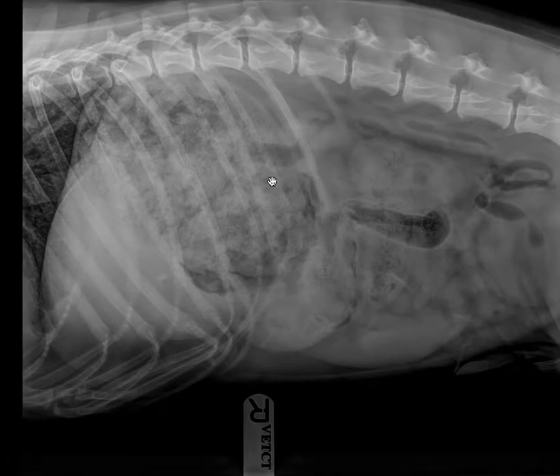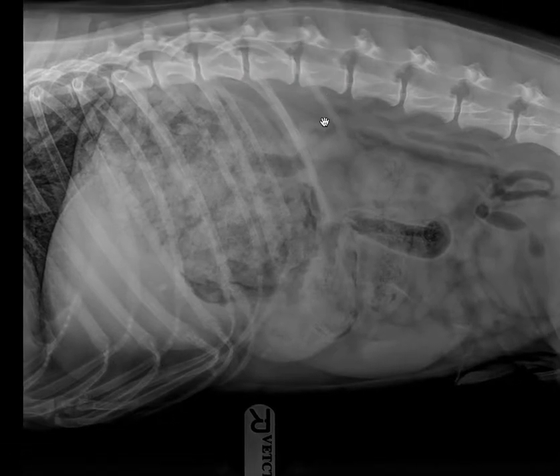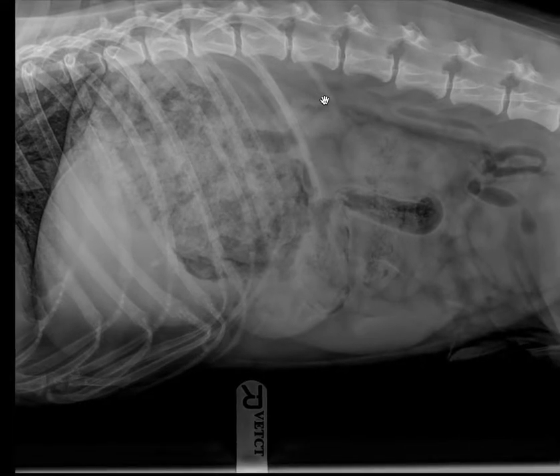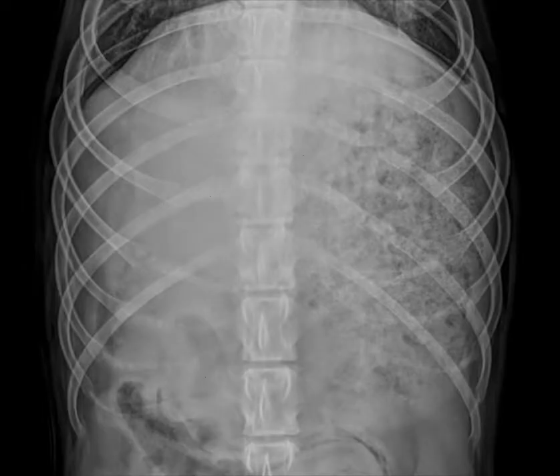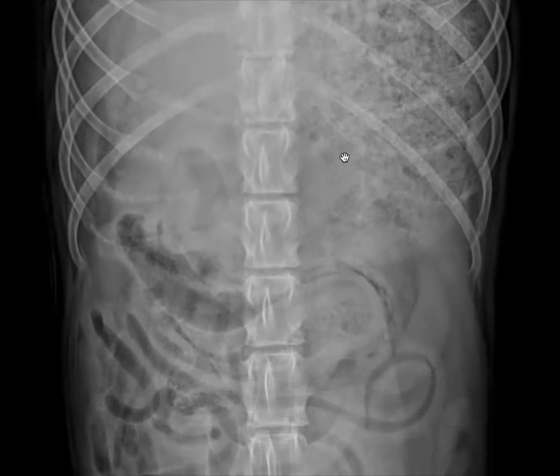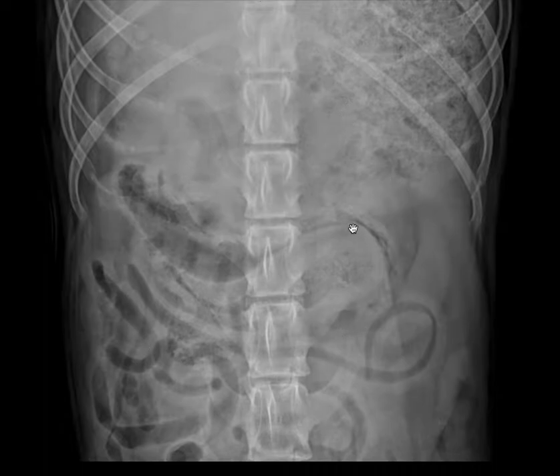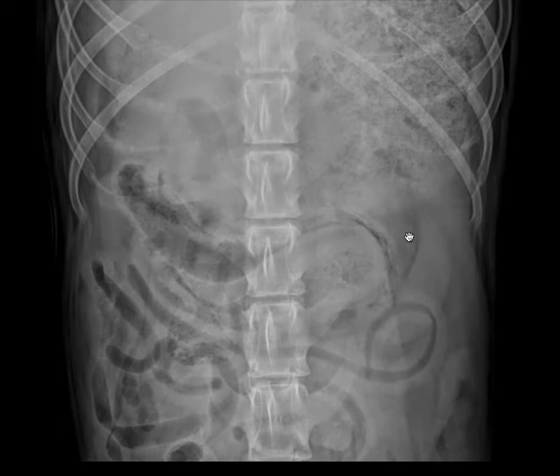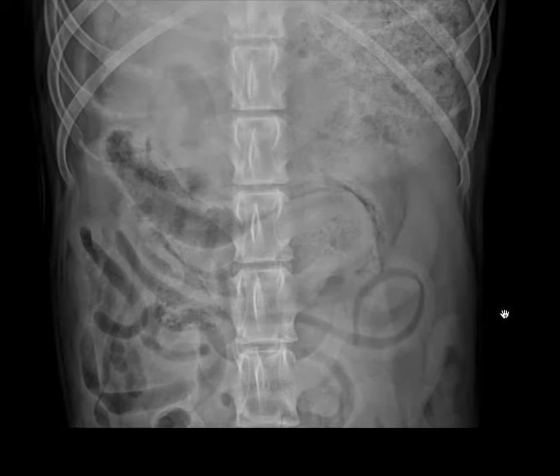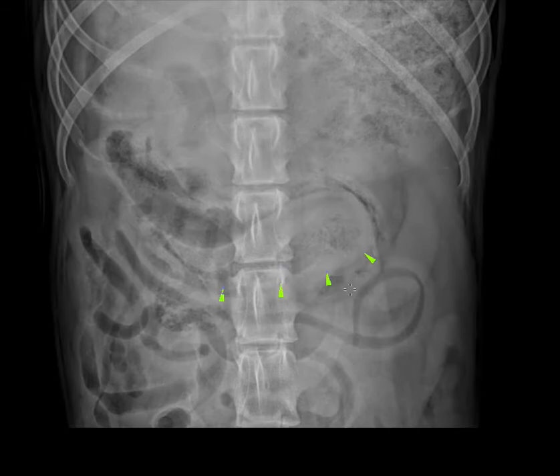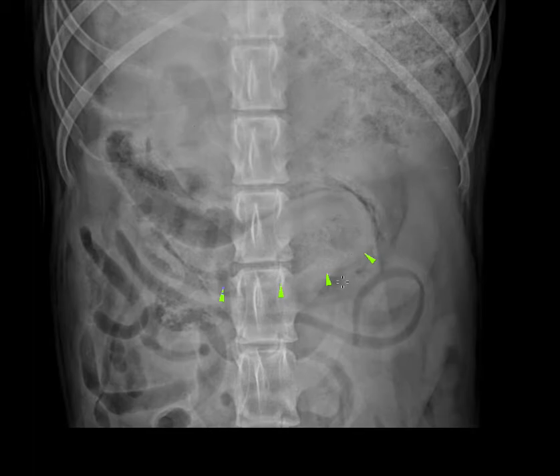So what else can we do to determine whether this is a surgical case or simply a case of a patient with delayed gastric emptying for a medical reason? The next thing that's important to consider is whether there are any abnormal findings in the intestine. Small intestinal foreign material can sometimes be difficult to differentiate from colon — this is the case with this patient. I'm going to point to a loop of intestine here that contains lots of granular contents. If this segment contained feces, this could be a normal diameter and normal contents. However, if this was a small intestinal segment, I would consider it to be excessively large and abnormal.